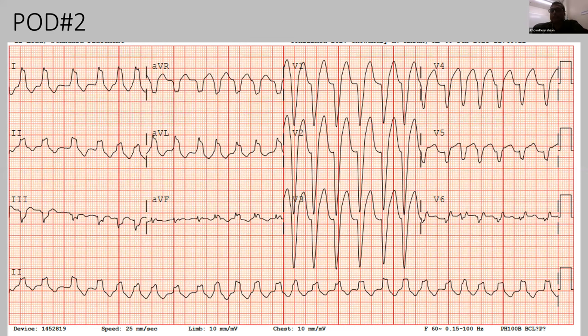How do we control this AFib rate? Because they feel lousy when they go into AFib with fast ventricular rate, particularly with this degree of left bundle and dyssynchrony. Any suggestion? Is this AFib paroxysmal or persistent? Well, this has happened following the recent CABG.